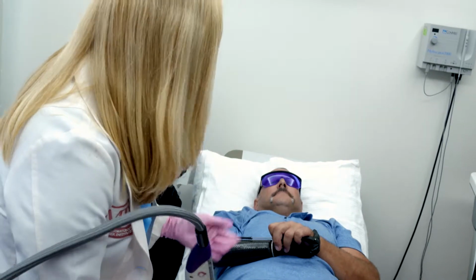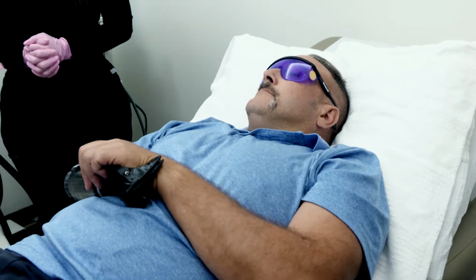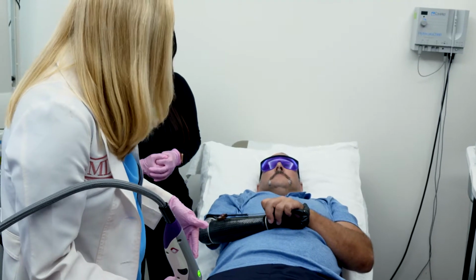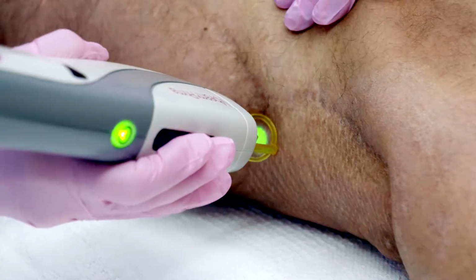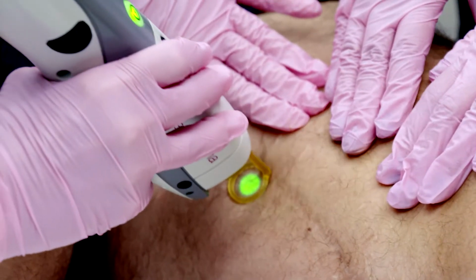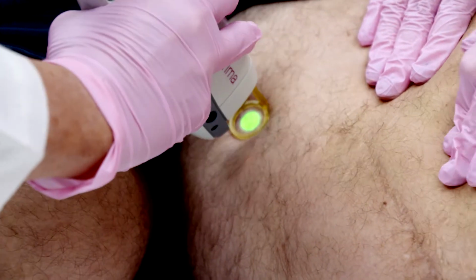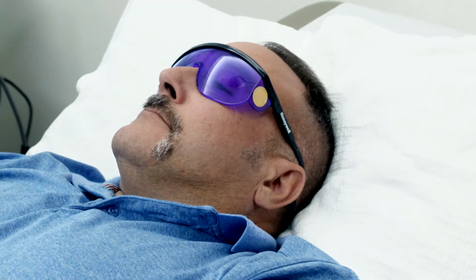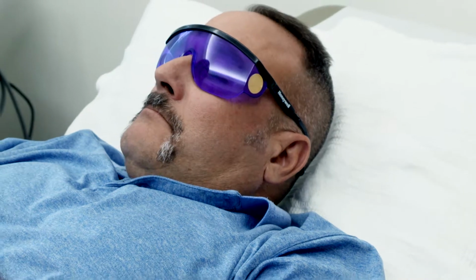So unfortunately, we see this for a lot of our amputations after IED injuries, that the leg that was saved often causes more problems than the prosthetic leg. Is that a true statement? Yes, ma'am. So what we're trying to do is get this leg as much back to normal as we can. What we're going to do with the Candela VBeam Prima is help these scars remodel. Scarring restricts motion, the muscles are all tight in there, and Rick has a lot of debilitating cramping.